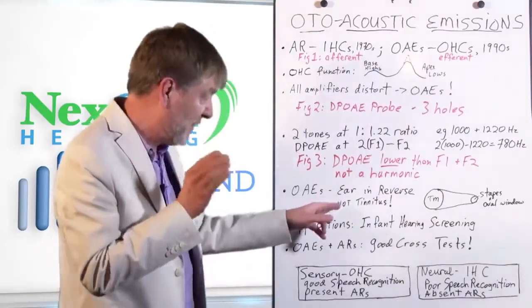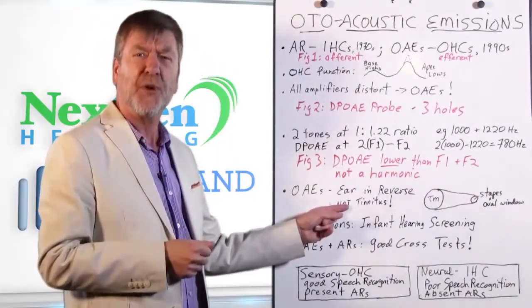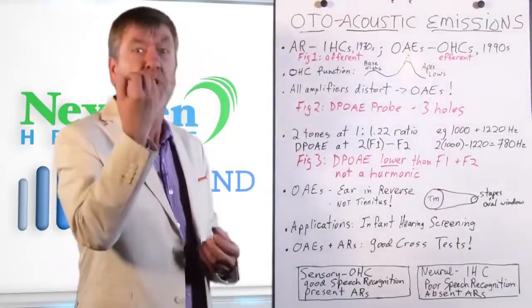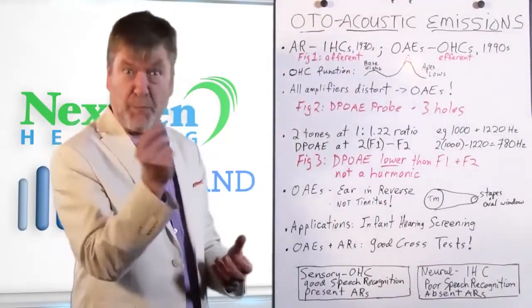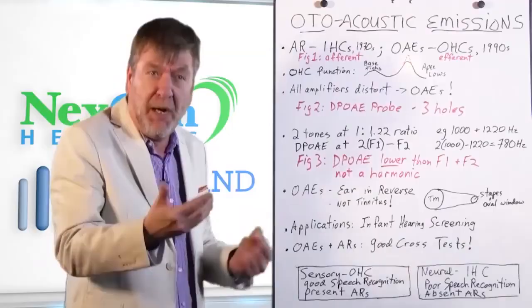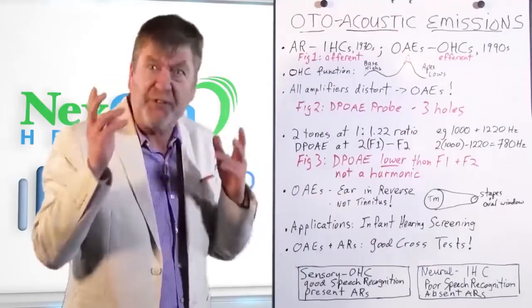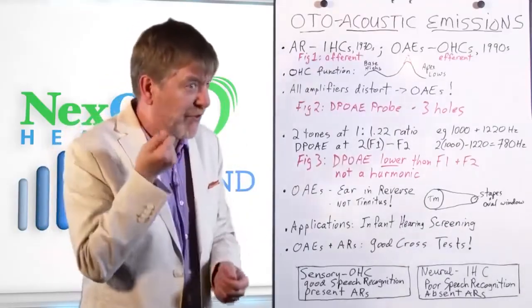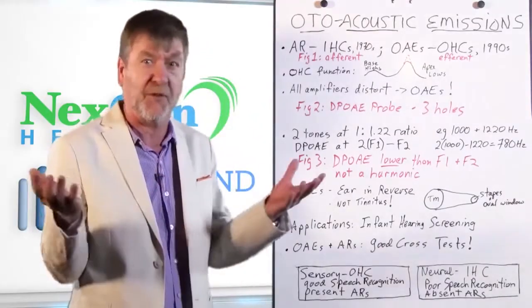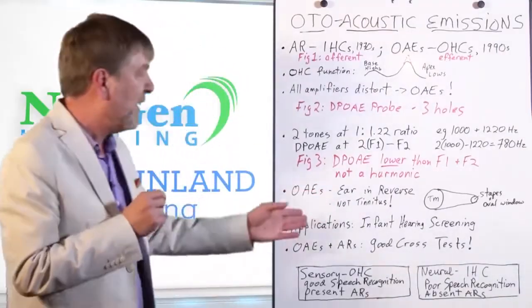However, another thing to realize is never confuse otoacoustic emissions with tinnitus. They're not the same. Otoacoustic emissions are an actual measurable sound that's picked up by the probe. Tinnitus is a symptom reported by a client, and only that person hears it. And it's driving them bonkers, but it's not like a physician is able to sit there and listen to someone's tinnitus, unless of course it's pulsatile, and then of course we know that it's more vascular in origin. But that's just something to take note of.